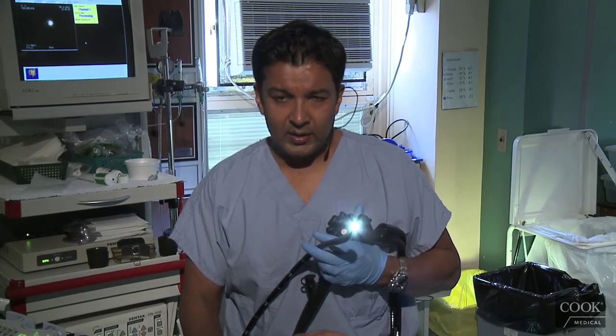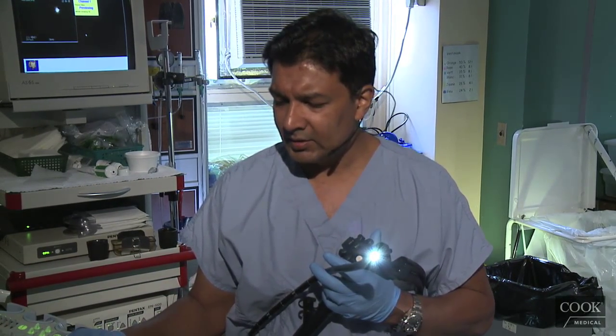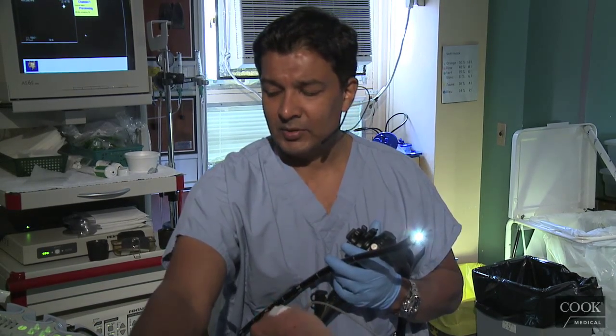This is a young lady with what apparently looks like alcoholic pancreatitis. She's got some probable pseudocysts on the scan, slightly elevated Alkphos, so they just wanted to make sure her biliary system is clear.